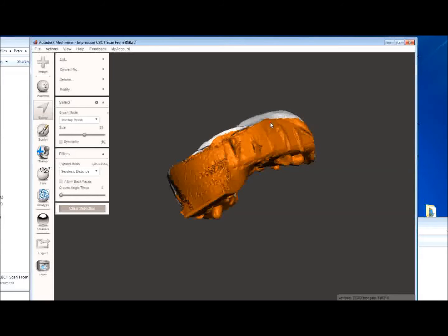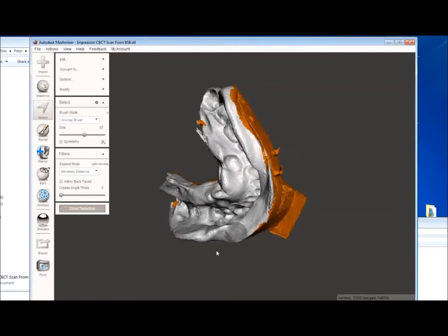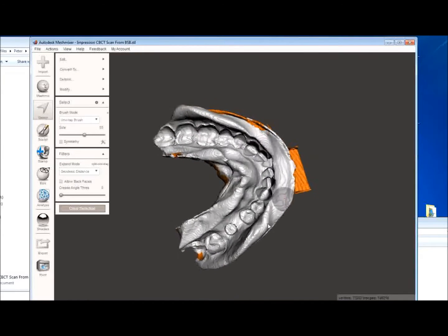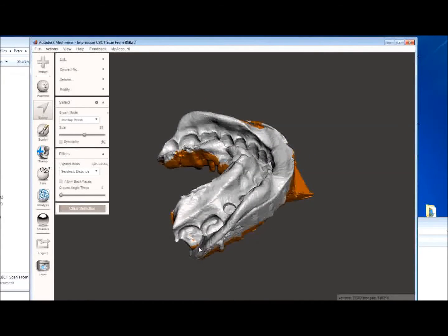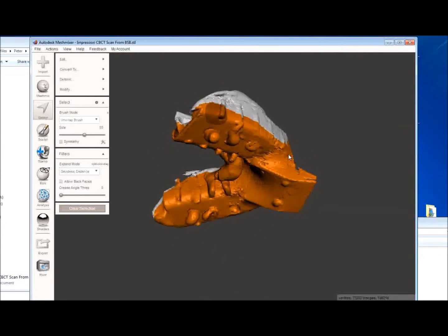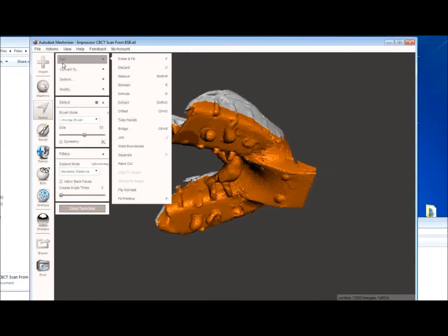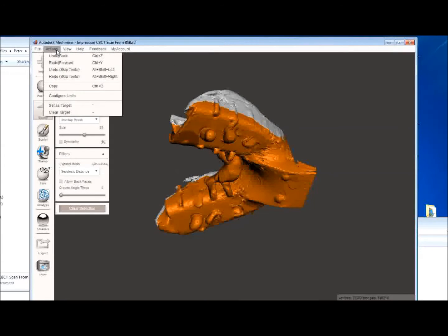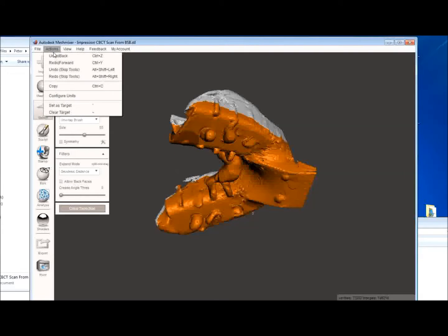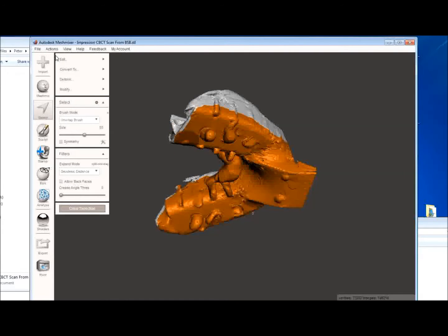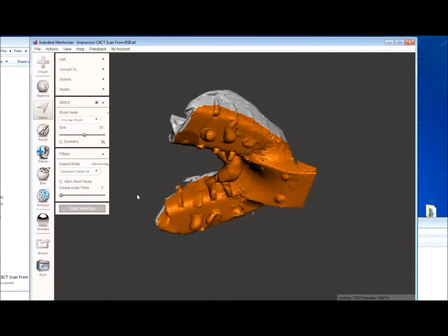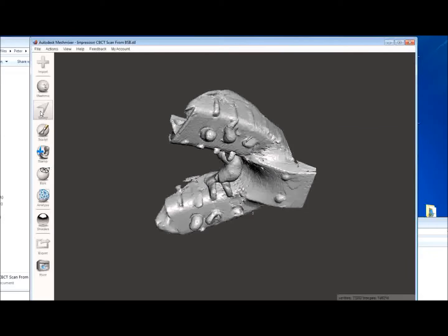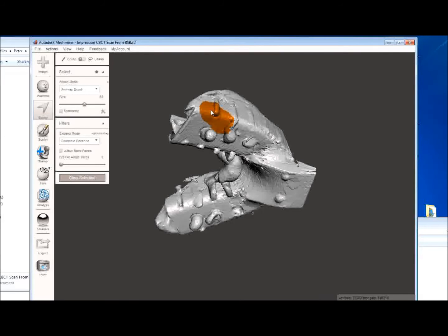And one thing I'll do is I'll rotate the image to make sure I haven't leaked over into the vestibule. You can see here we've leaked a little bit. So what I'm going to do is actually start over. And clear selection. Go back to select. And start painting again.